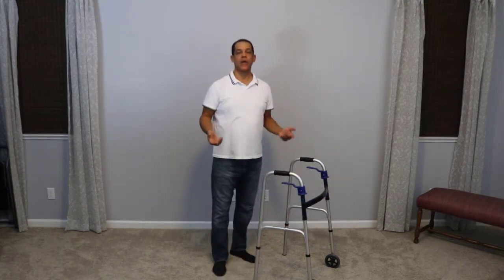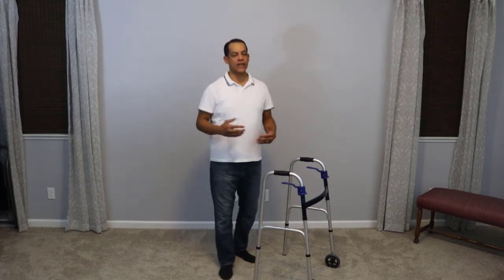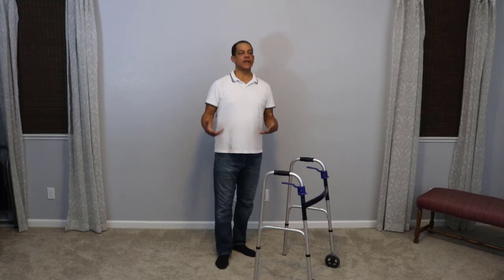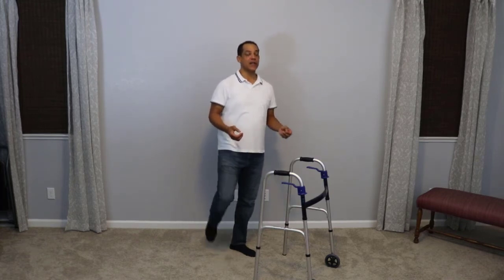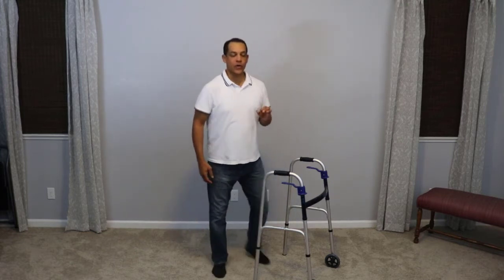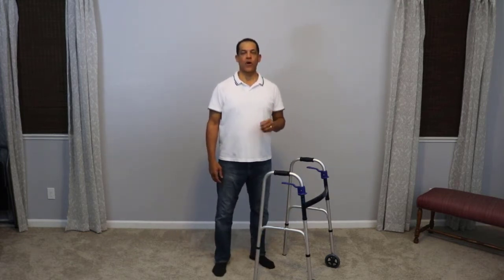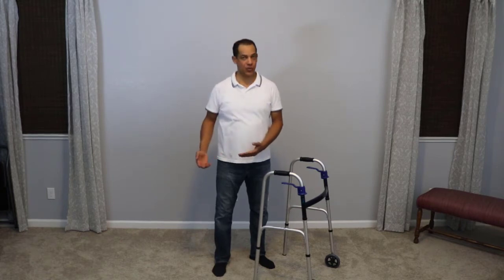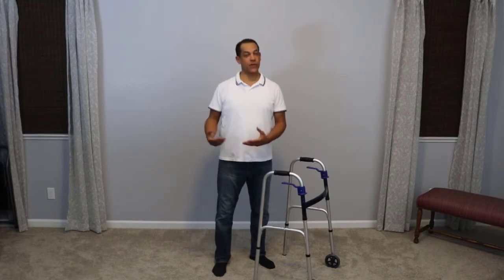Today's video we're going to talk about how to use a walker with one leg. I did make another video about how to use a walker when you're non-weight-bearing on one leg — generally you're non-weight-bearing after a surgery, if you break your ankle, and the doctor has you at a non-weight-bearing status. It may be that you've actually had your leg amputated, had some sort of injury, had your foot operated on — whatever the reason you may be using a walker with one leg.